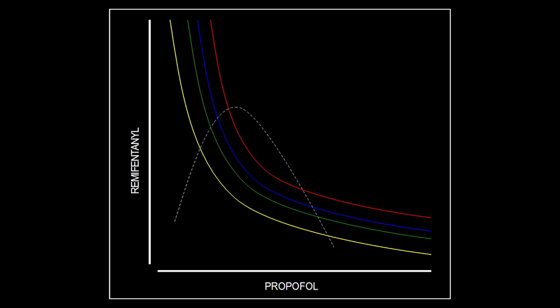The main weakness of this system is that the interaction model does not use the probability of non-response, PNR, as an objective variable. For these systems, the PNR is a variable outcome that is calculated based on the doses that are being administered. This means that the anesthesiologist, despite knowing the PNR, cannot adjust or modify it according to the anesthetic requirement.